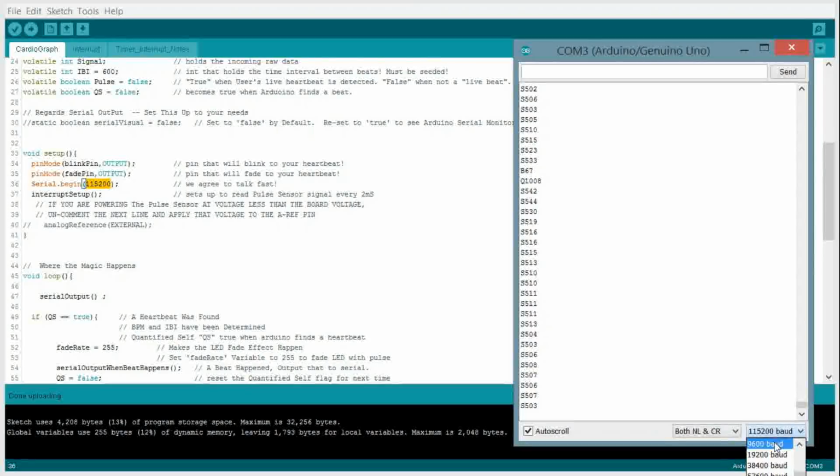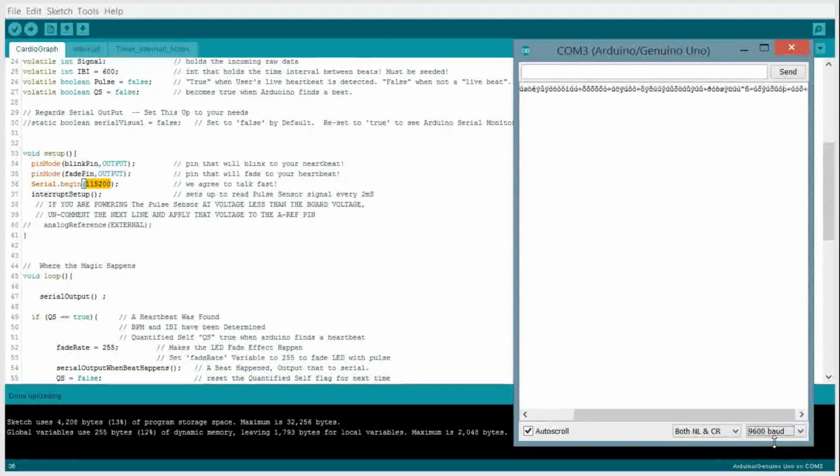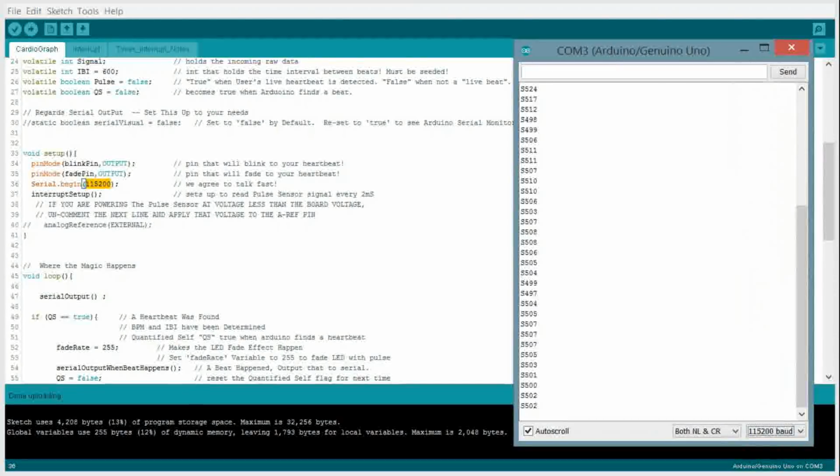For example, I'll put on 9600 here. See what happens? If that's what you're getting, that's probably the reason: those things aren't matching. So make sure they match. And you're also going to make sure those match in your processing sketch. If they don't, they're not going to talk. They're not going to understand each other. So that's something to be aware of. I know some people have problems with that. They just don't change the baud rate.